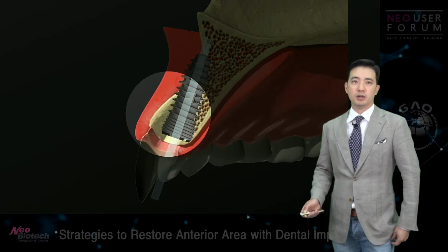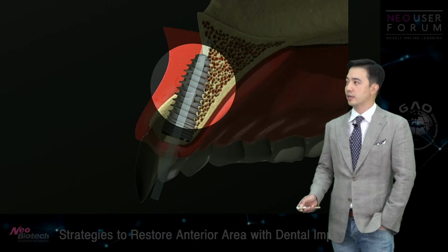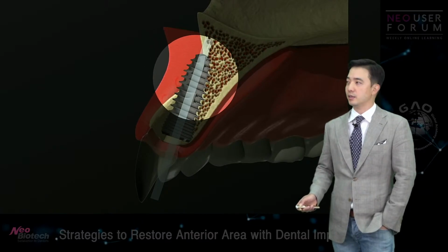So you end up having an exposed apical area of the implant like this.